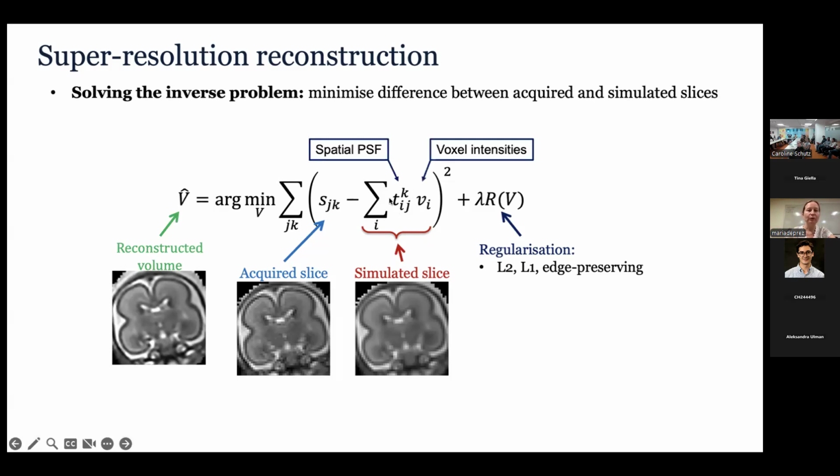But of course, then there is the question of how you get this point spread function. I have the next slide about that. But before that, we have the sum squared error loss, plus we have a regularization term, and we have to have a regularization term because this is an inverse problem. If you didn't put it in, you would get something extremely noisy and you would not see anything, basically. In a simulated experiment, when there is no noise, it will reconstruct without it, but with real data, it will not.